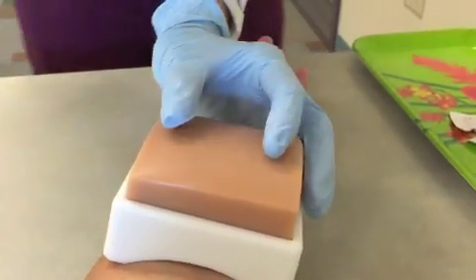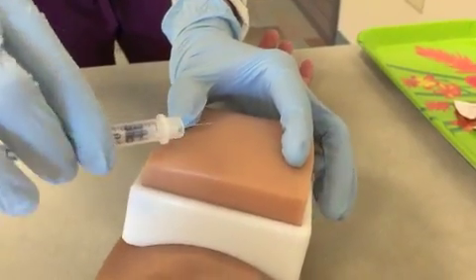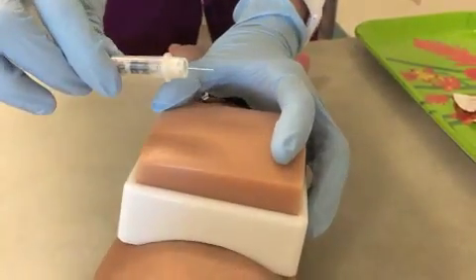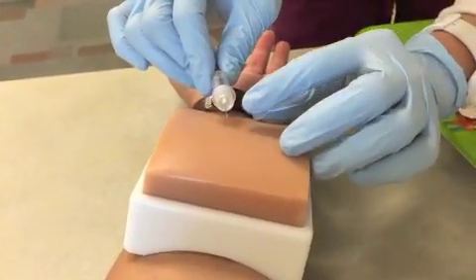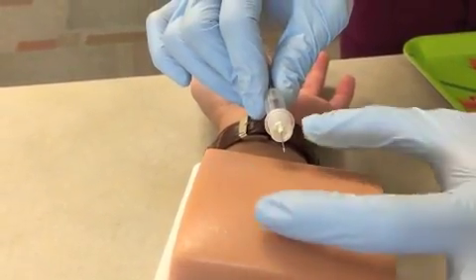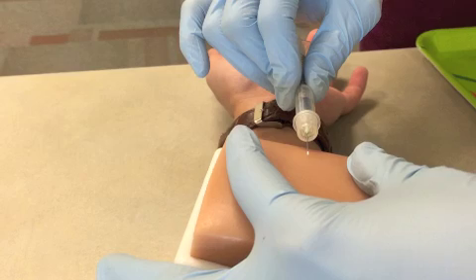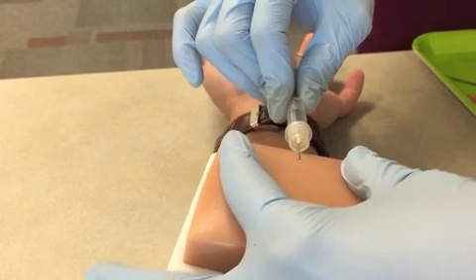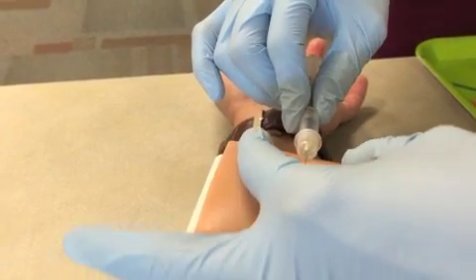Now you want to hold the skin taut just a little bit. The ID, you want to do it at a 10 to 15 degree angle. And you want to make sure that the bevel of the needle is facing up. Okay, so now you go ahead and tell him you're going to feel a little pinch. You push it in just as soon as you can't see the bevel.